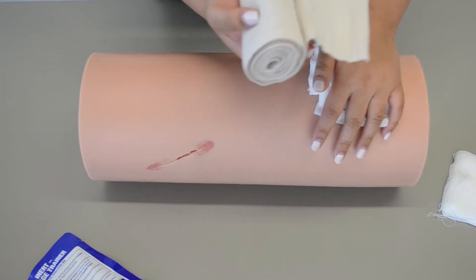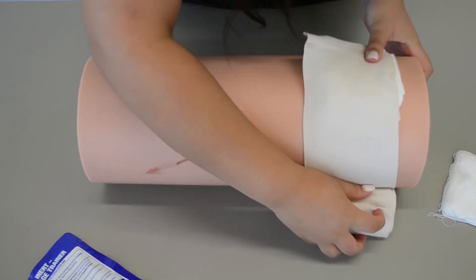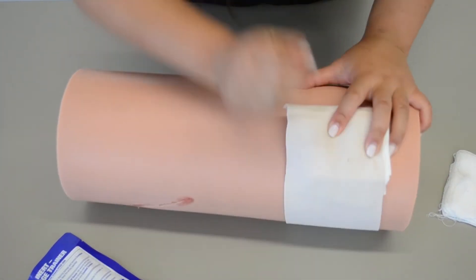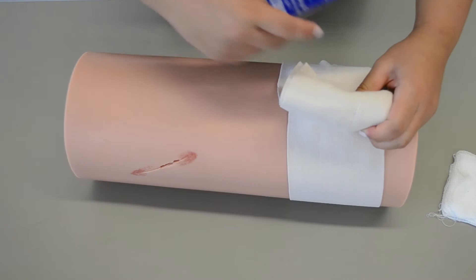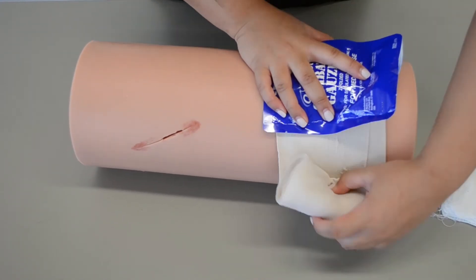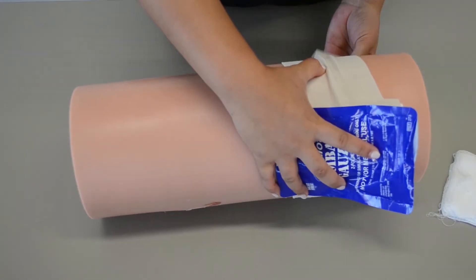After three minutes, I'm going to take my bandage and wrap it around the patient. Then I'm going to go ahead and place the combat gauze packaging right there so that medical professionals know that a combat gauze has been placed on this patient.